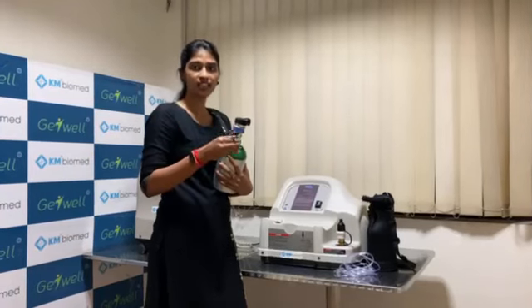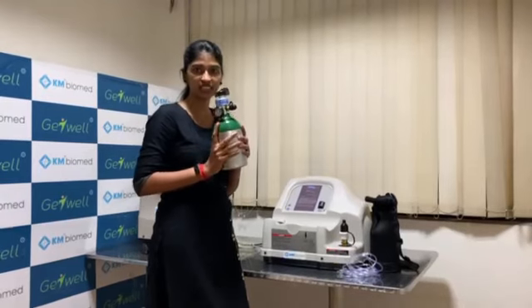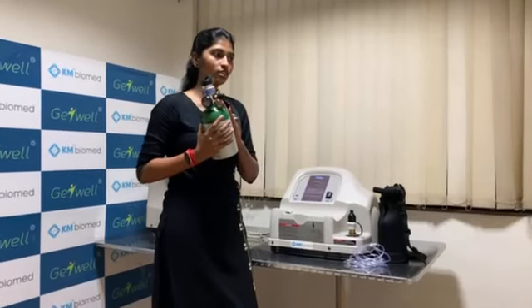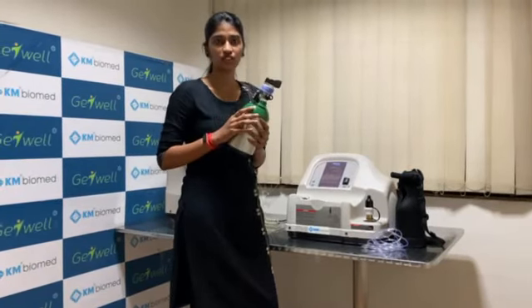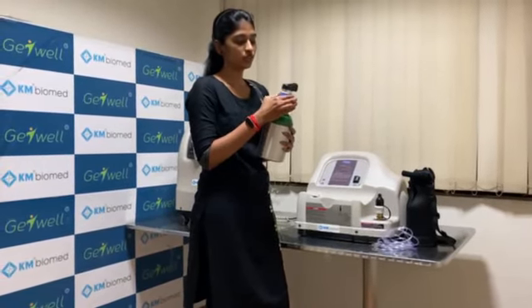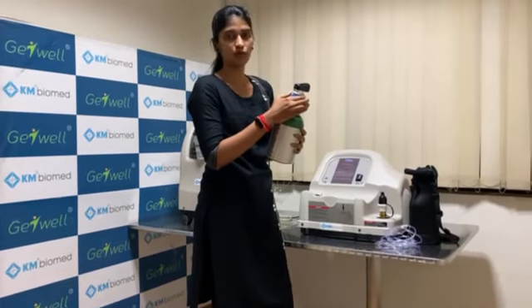Whenever you are exhaling, the oxygen delivery is stopped to store oxygen and avoid wastage. In a continuous flow system, oxygen would be wasted during exhalation. They have designed this to prevent that waste, especially since we are in greater demand of oxygen. Whenever you inhale, the system delivers a puff of oxygen, and you can also hear the puff sound.